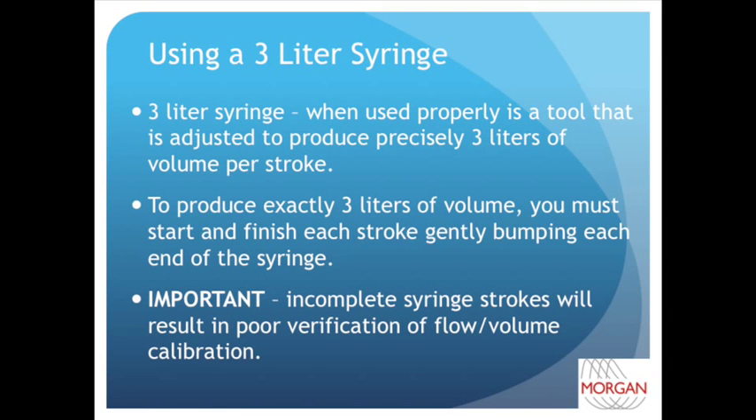To perform a flow volume verification like the one you just saw, you need to use a calibrated 3-liter syringe. When used properly, a 3-liter syringe will produce exactly 3 liters of volume per syringe stroke. A complete expiratory syringe stroke means you must start with the syringe piston completely pulled out and push it in until you gently bump the piston head against the inside of the syringe.